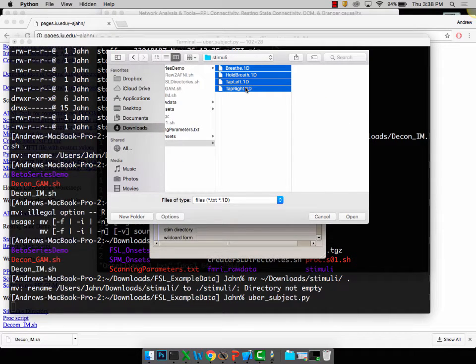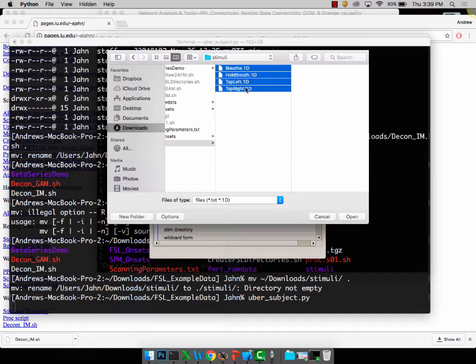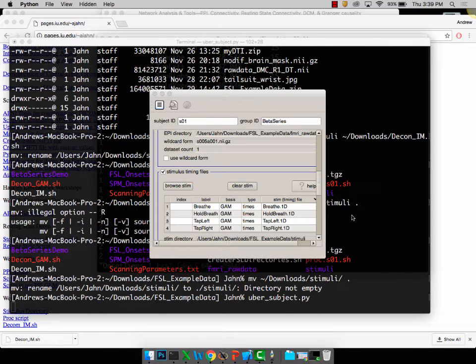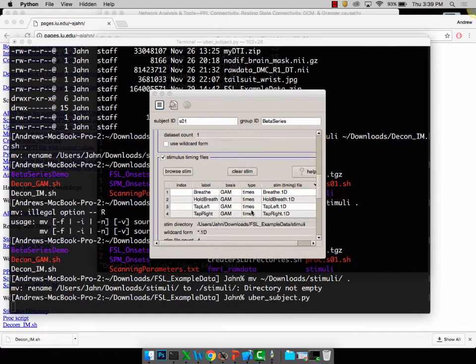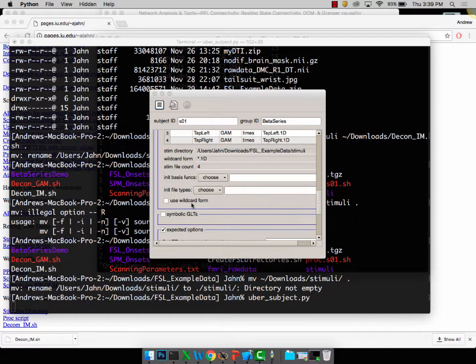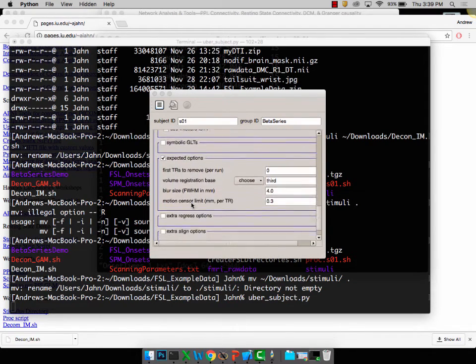Lastly, stimulus timing files. If you go back to wherever you put the stimuli, just select all of these. A little bit of background on this experiment. This was back when I was in graduate school, a long time ago. We had a nicotine administration device we wanted to use inside the scanner. We wanted to know whether it would induce any artifacts if somebody was being scanned while smoking. To pilot this, I went in there and put this thing next to my head to see if anything would happen. Things like holding your breath, then breathing, tapping left and tapping right. Really simple stuff just to see whether the data looks okay.